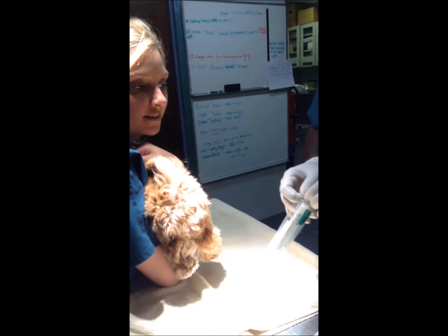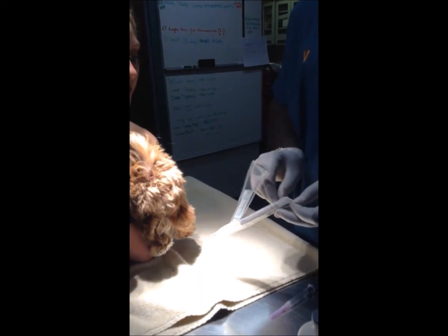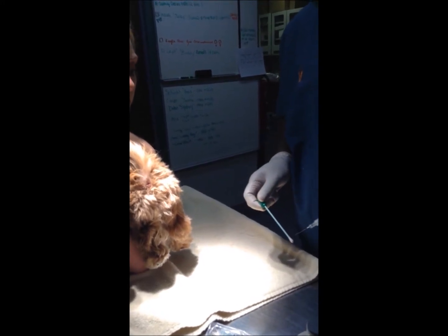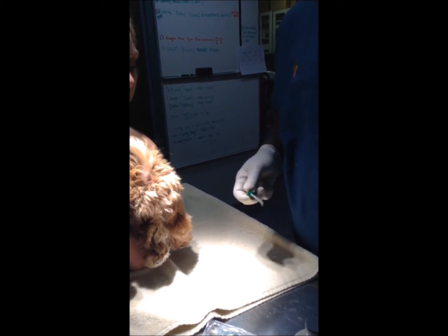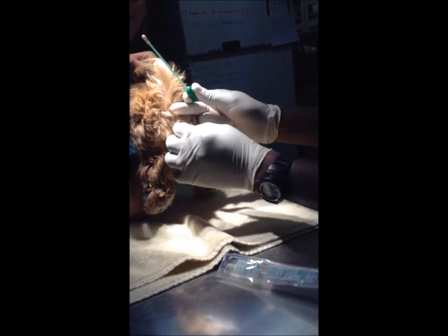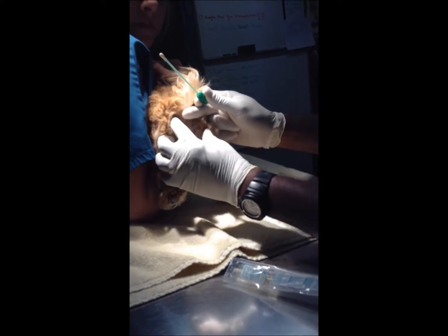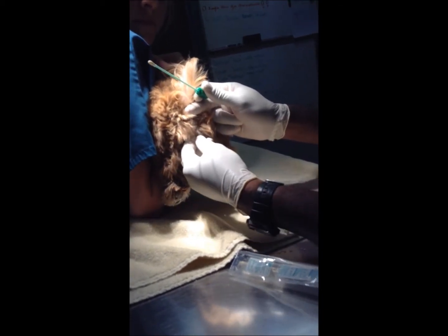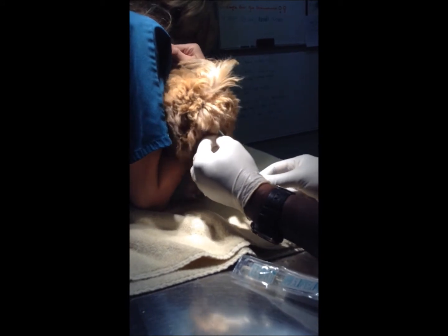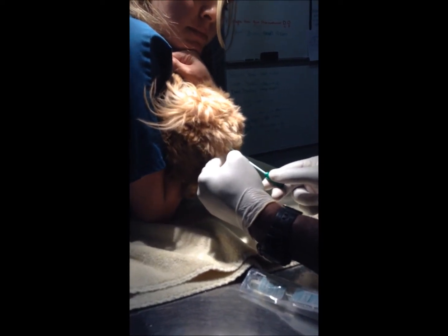Okay, we're getting ready to start a prep for a vaginal cytology. We're actually going to use a sterile culturette swab. We're going to moisten it with a little bit of saline and then insert it in the vagina. Expose the vagina. Going to insert in the vagina, that's fluid. Point up and go around, okay, and get us a nice cytology.